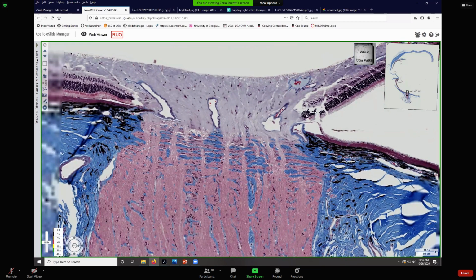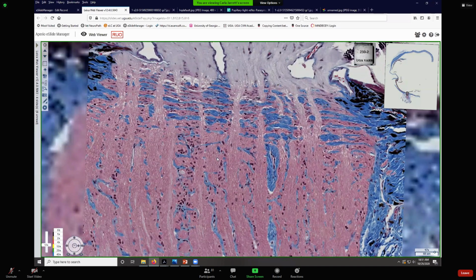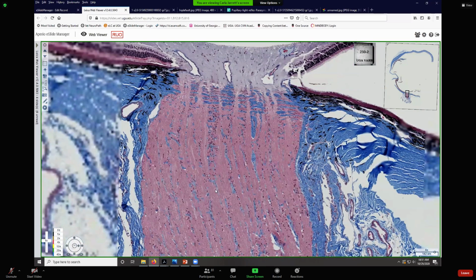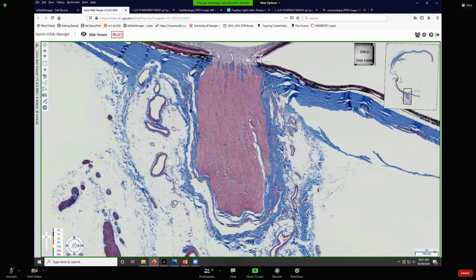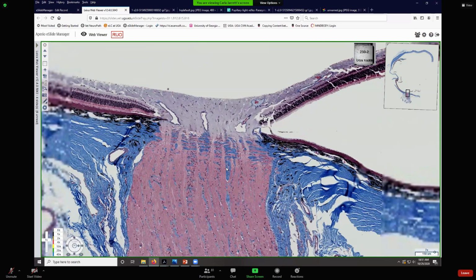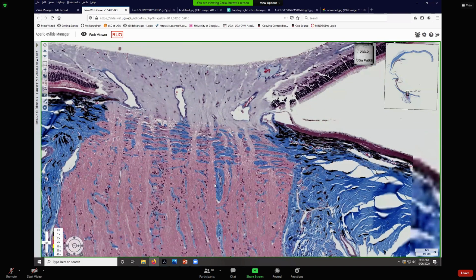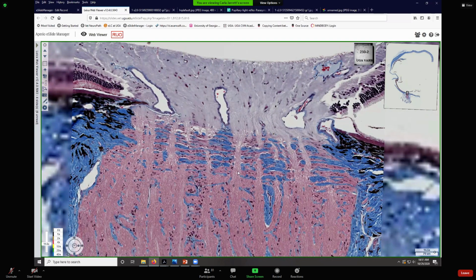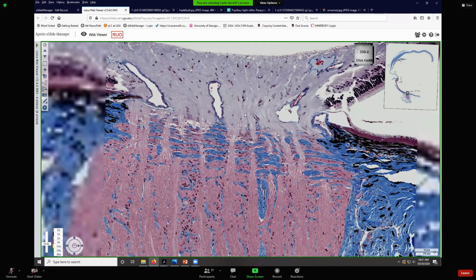Then we don't have a retina right here because it's obliterated by all these axons. They're penetrating through the sclera at an area called the lamina cribrosa, that means the sieve. And as soon as they penetrate into the sclera, bam, now look, they're myelinated, okay? And they form this really big, thick optic nerve. And that's going to go all the way back to, it's really an extension of the central nervous system. So that is your optic nerve, and it's going back towards the brain, okay?